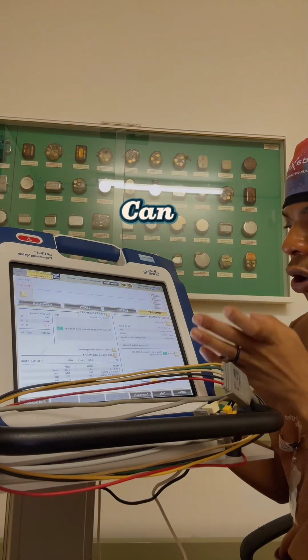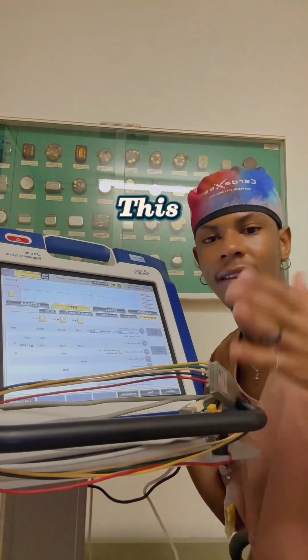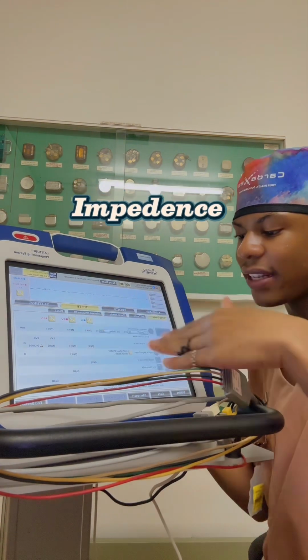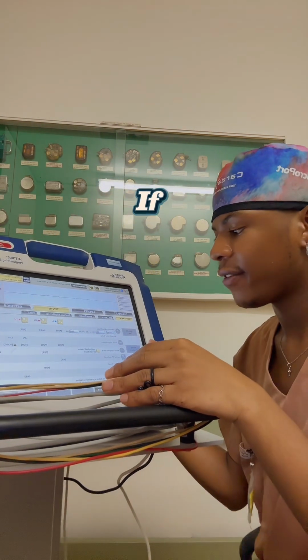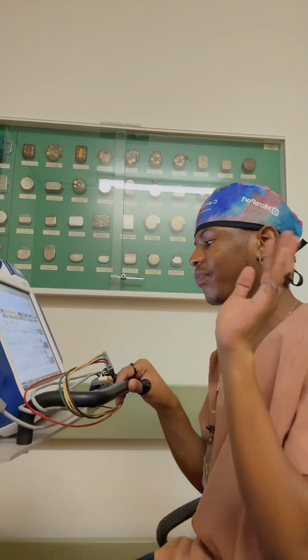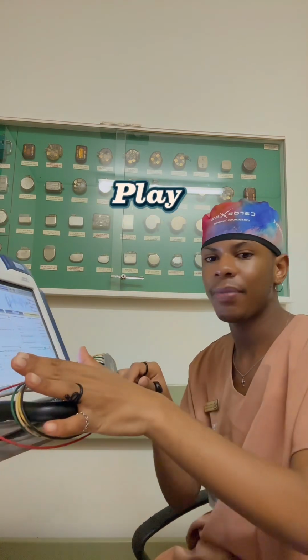You can also come here, but obviously this is a demo. It's not a real interrogation. So you can test your impedance, you can test your thresholds, and you can see if your patient has intrinsic activity, which is their own electrical activity. That's basically it. We just play around with this.